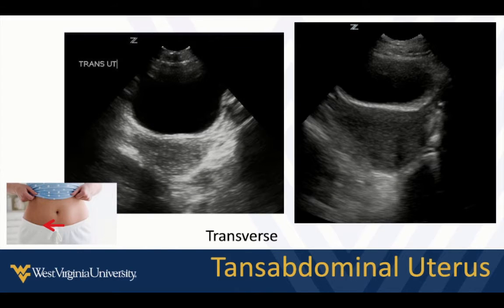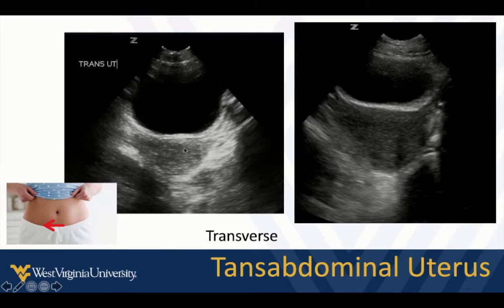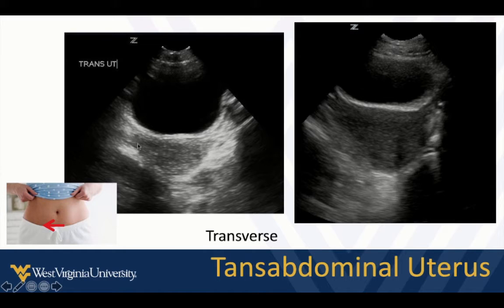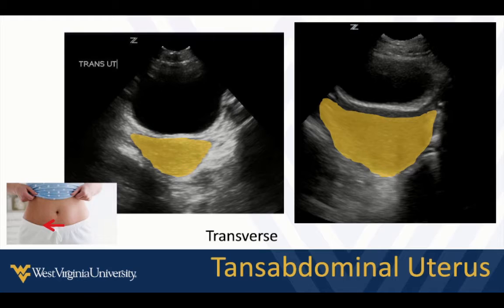We also do transverse views, which is often what we're going to do when looking for free fluid. We see the bladder, and as we fan — usually more towards the patient's head — we will see the uterus. Usually it's going to look like it's posterior to the bladder, although that depends on how full the bladder is and the orientation of the uterus, which can be a little variable. It's this muscular-looking structure usually behind the bladder.